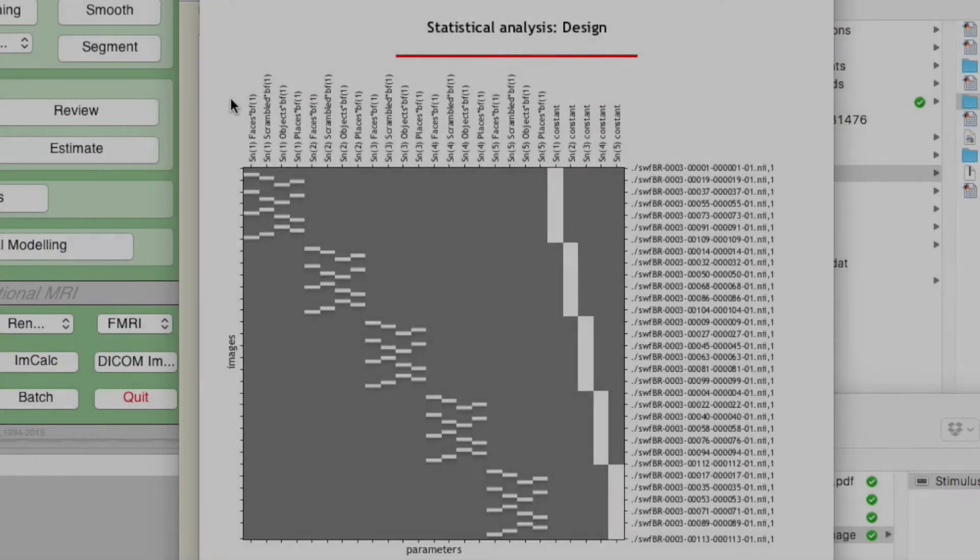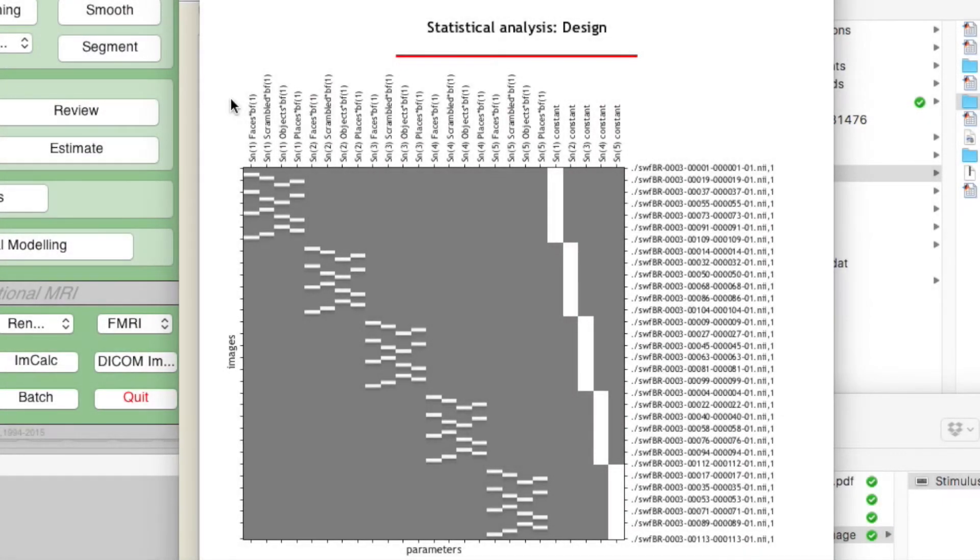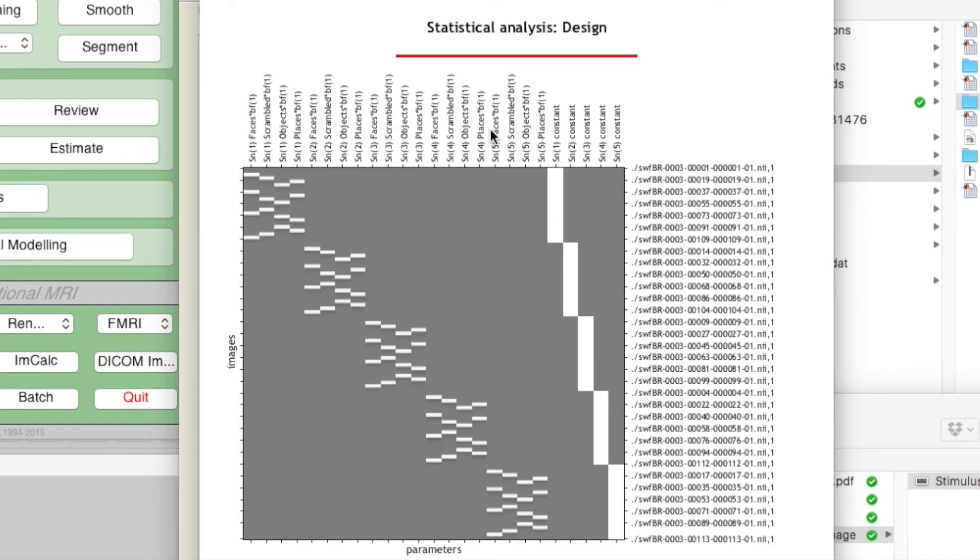Once you've specified the first level statistics you can now estimate them, but it's always a good idea to check that you've done everything correctly. When you set up the stats, by default it shows you the design matrix which we'll look at now.